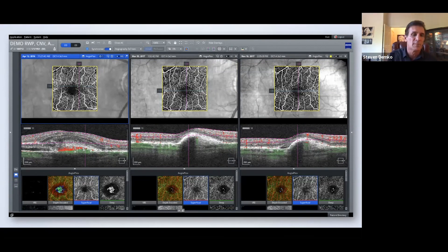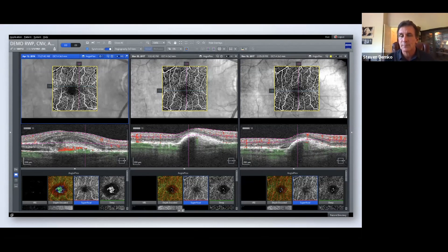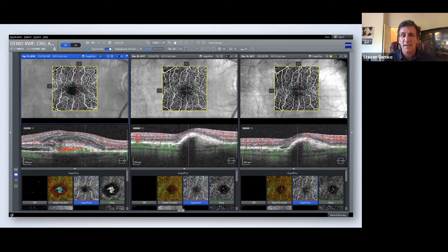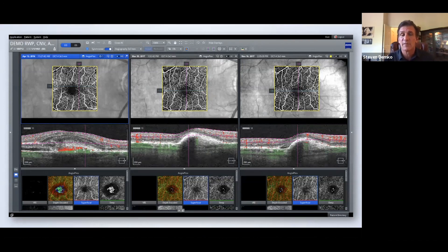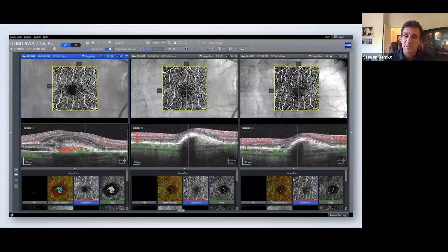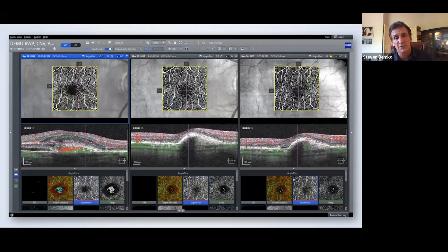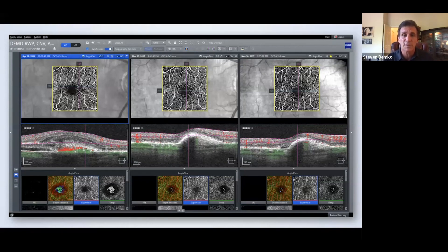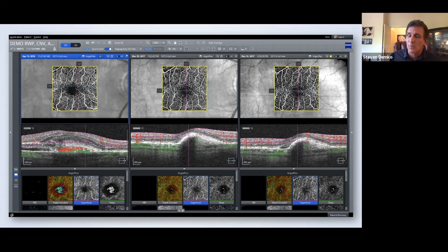And you can see down below that this is starting to get a coiled neovascular membrane. So what I do in my practice, the only time I send anything to an ophthalmologist or to a retinal specialist is when it needs to be treated. I can manage these patients about 80% of the time, very effectively, just using the OCT and the OCT with angiography. And if there's any questions, then I'll send them to the ophthalmologist for a fluorescein angiography and for treatment. And a lot of times that we'll be starting to treat these patients based on the angiography portions, because sometimes the fluorescein doesn't pick up the images that I'm seeing with the 6,000.